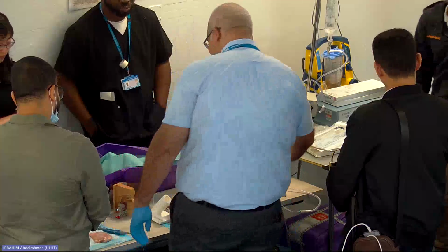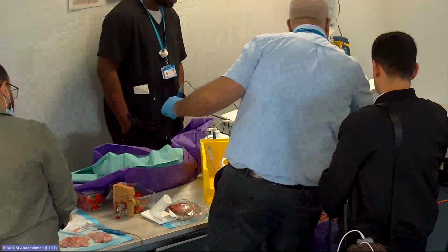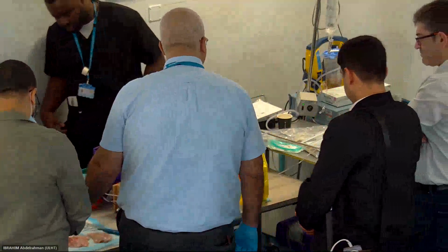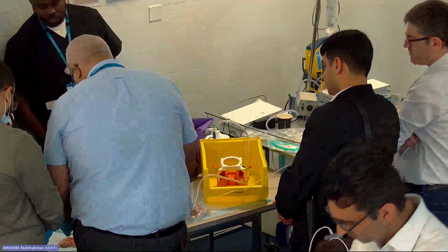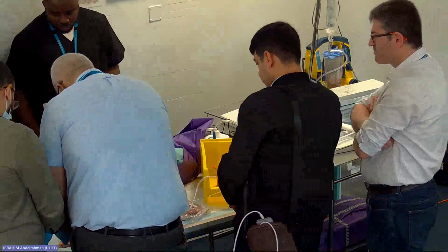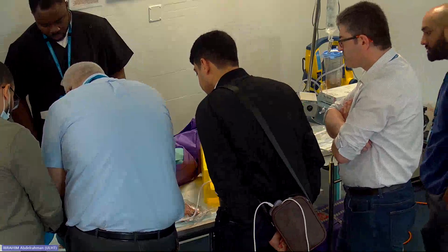Okay, thank you. Guys, I'll just go through what I do, simply, just to make it easy for everybody to try it. So listen to the sounds, you know what I mean? You can let yourself get used to the sounds. As Liam mentioned, look here, see what I'm doing. So imagine the tonsil, this is a child's tonsil. What I'm doing here, I'm painting.